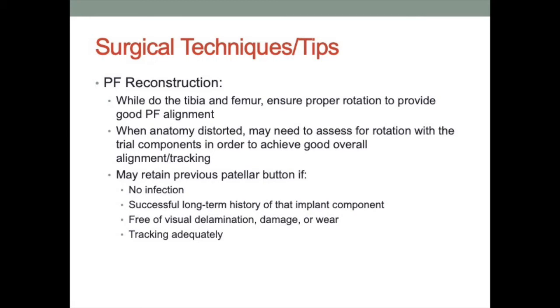You can also retain the previous patellar button if there's no signs of infection, it's an implant with a successful long-term history, it's free of visual delamination, damage, or wear, it's still well fixed, and there's adequate tracking, so you're not obligated to redo the patella every time you go in after a knee.